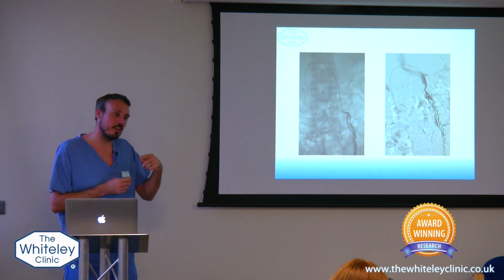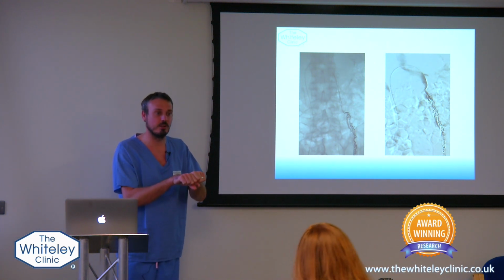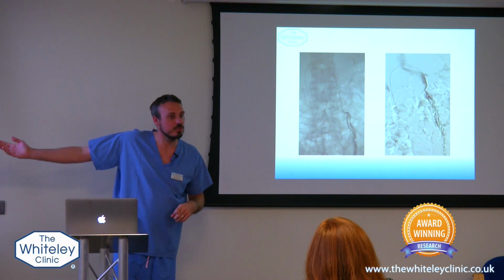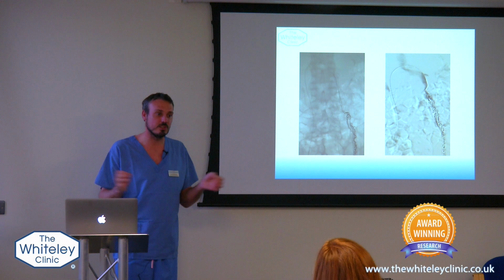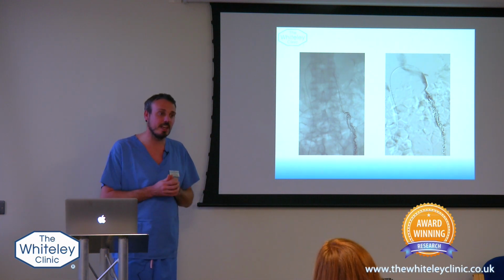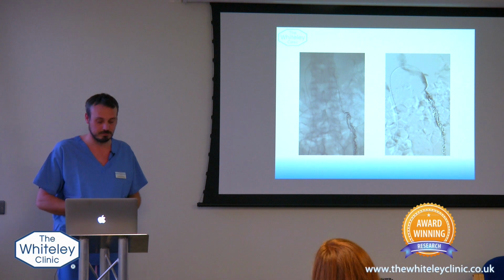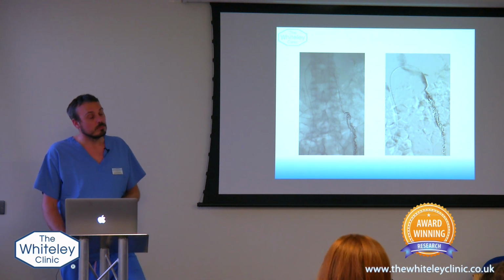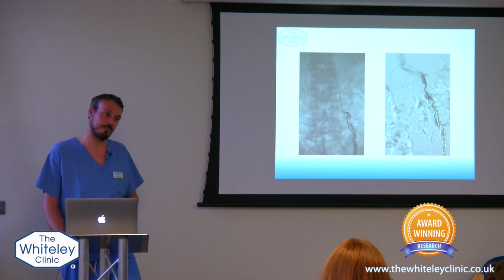The vein essentially, in 2 days nothing's going to happen other than the vein clamps down under the coil. 2 weeks, 2 months, 2 years down the line, that vein's just fibrosed. Coil remains, blocking that vein. Blood's found a different route, and therefore you haven't got the reflux pouring down into the pelvis anymore. Right. There's no danger that it could get out around the coil and into some sort of cavity or outside of the vein structure? The blood? No.